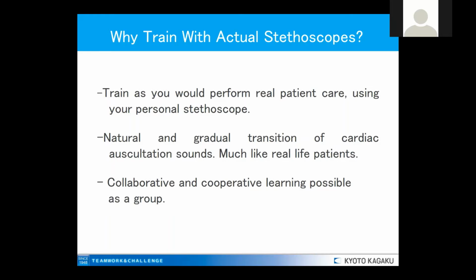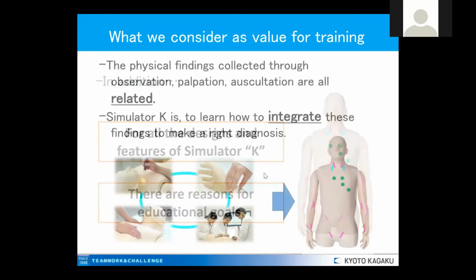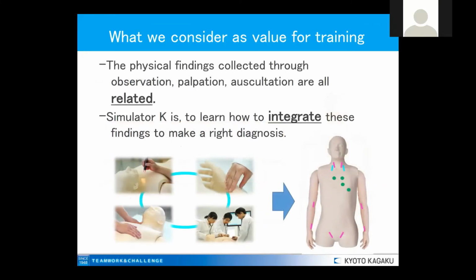So this is also a technical or logistic benefit that the simulator provides for the teachers, to get more students practicing in less time. So we have included all these looking for educational goals that help the teachers make their work easier.